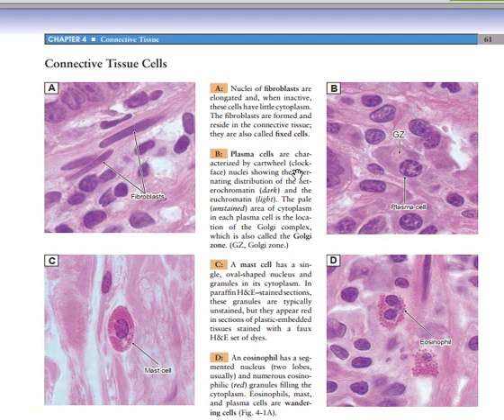Now, the next thing are the plasma cells. How are plasma cells represented on histology? On histology, the plasma cells are characterized by the cartwheel appearance. That is a clock face. You see the clock here, as if it is a clock with the different points of the clock. That clock face represents a distribution of heterochromatin and euchromatin on the light microscope. It also has a Golgi complex at the level of the Golgi zone. These are the two main representations of plasma cells.